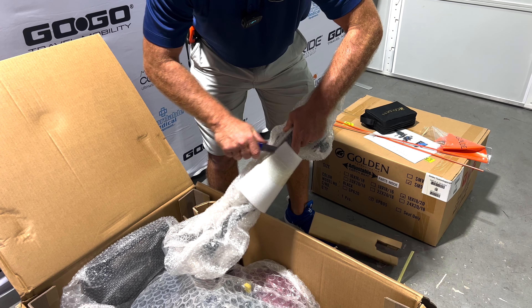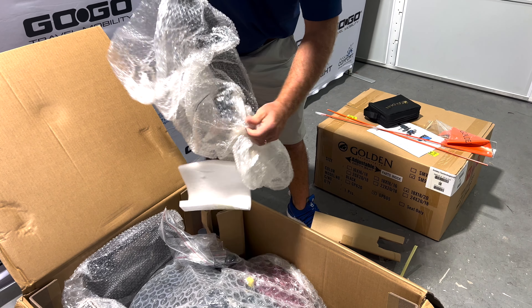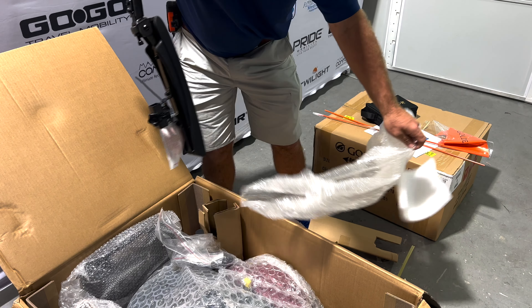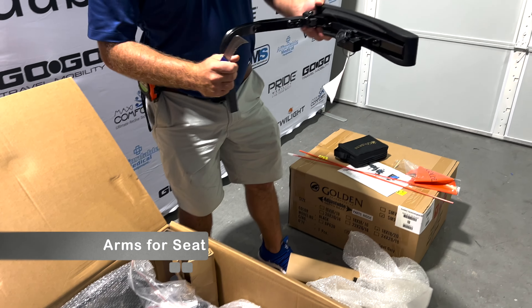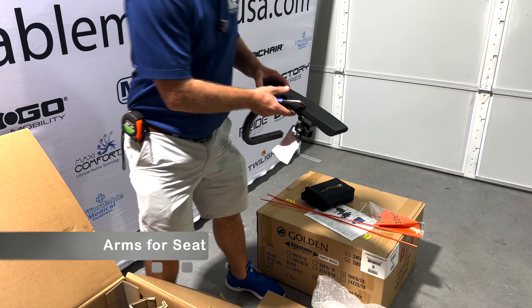Again, this is going to be just an unboxing. We will be doing a review video of it, so we're not going to go too much into it — just showing you what you would expect when this shows up to your house. This is the right arm. This also can be moved to the left side, so it can be interchangeable, right or left.